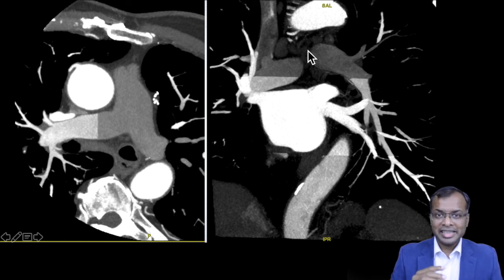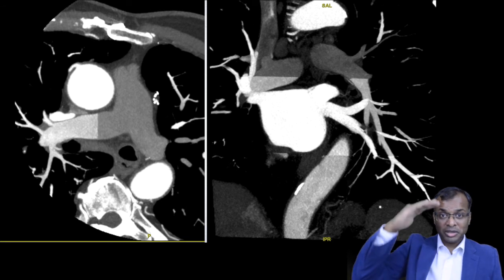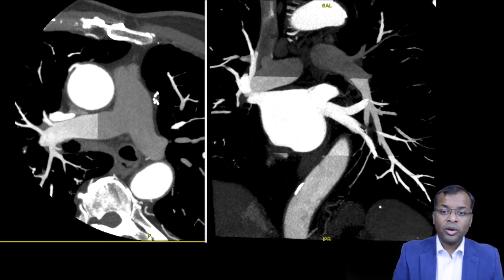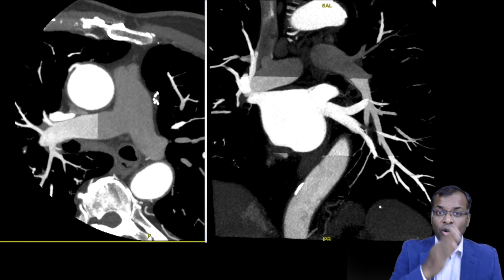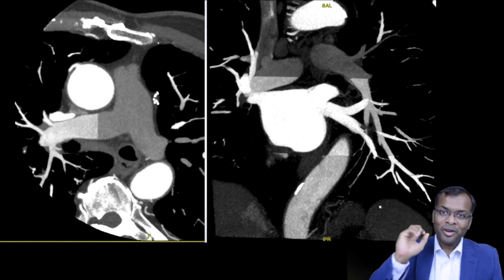So in this case, this is a gated study. The scan has started from the bottom and gone upwards. And as time has gone, the contrast has washed out. This especially happens if, remember the 40-30-30 principle, in the third bit you are not injecting contrast.